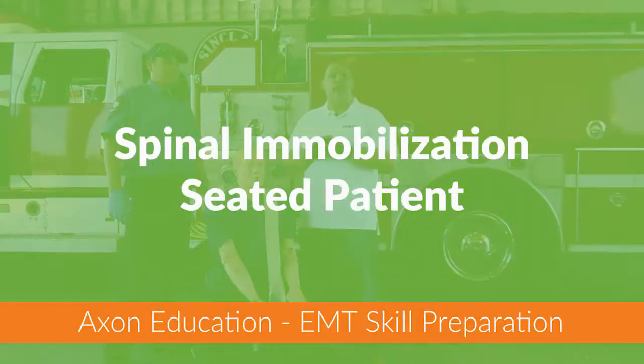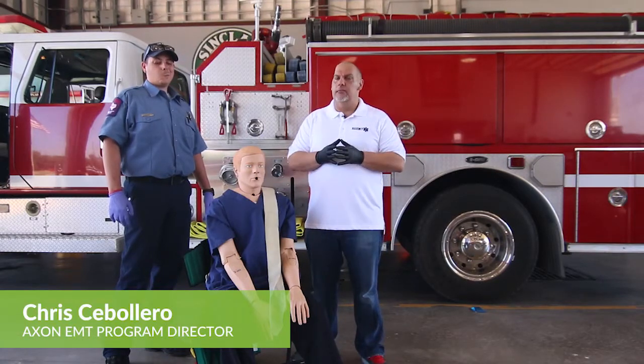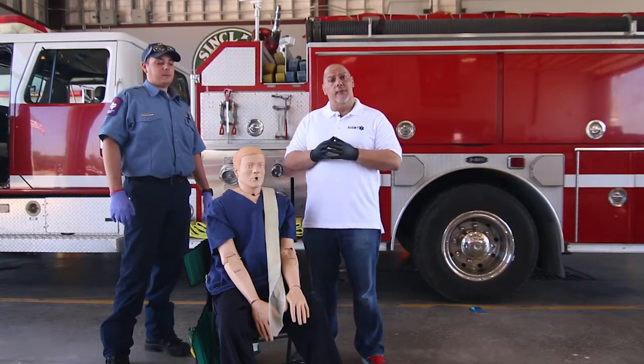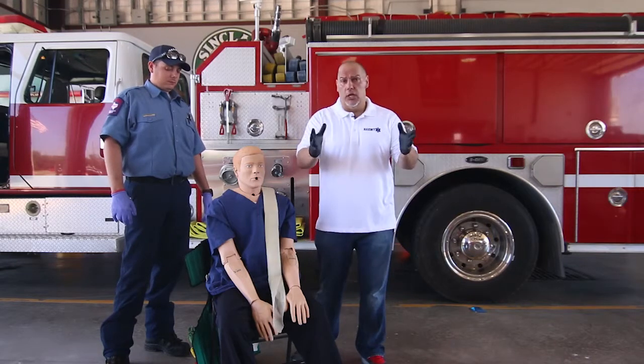Welcome back. Here we're going to talk about spinal immobilization seated. One of the things we're going to be talking about is that there's been a real change in the spinal immobilization philosophies over the past couple of years. Right now, we're going to talk about seated extrication, the KED seated extrication, as well as the longboard.